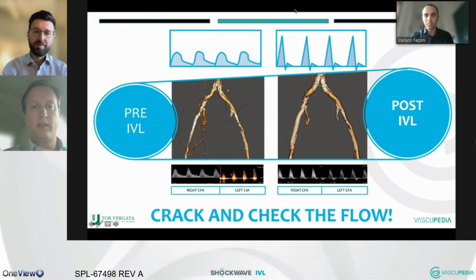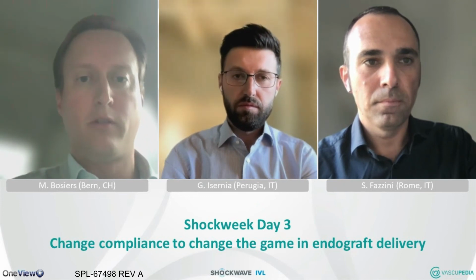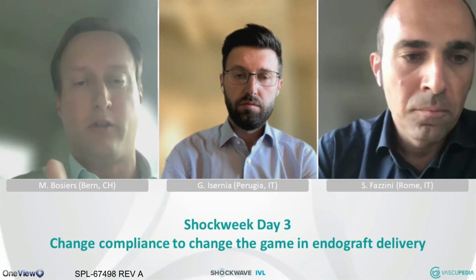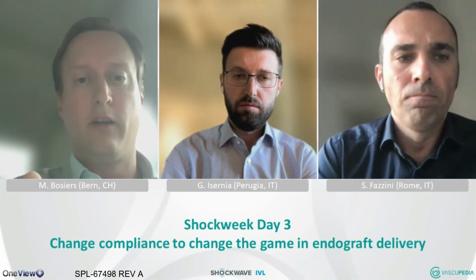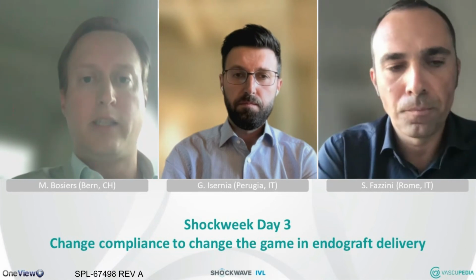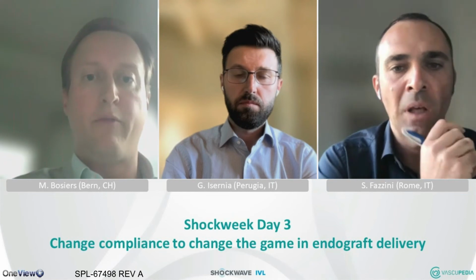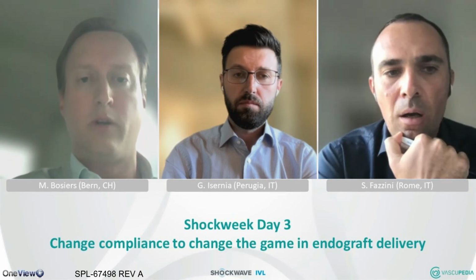Thank you, Stefano. Excellent case. Regarding your last slide, if you can stop sharing your screen for a moment. Check the flow. How do you check the flow? Do you check it directly post-procedure? Is the patient still on the table? You have an ultrasound system, I assume, because you puncture with the ultrasound. Do you check it afterwards, especially in these kinds of patients, to see if your treatment was sufficient, if they have aortoiliac occlusive disease, or how do you do it?